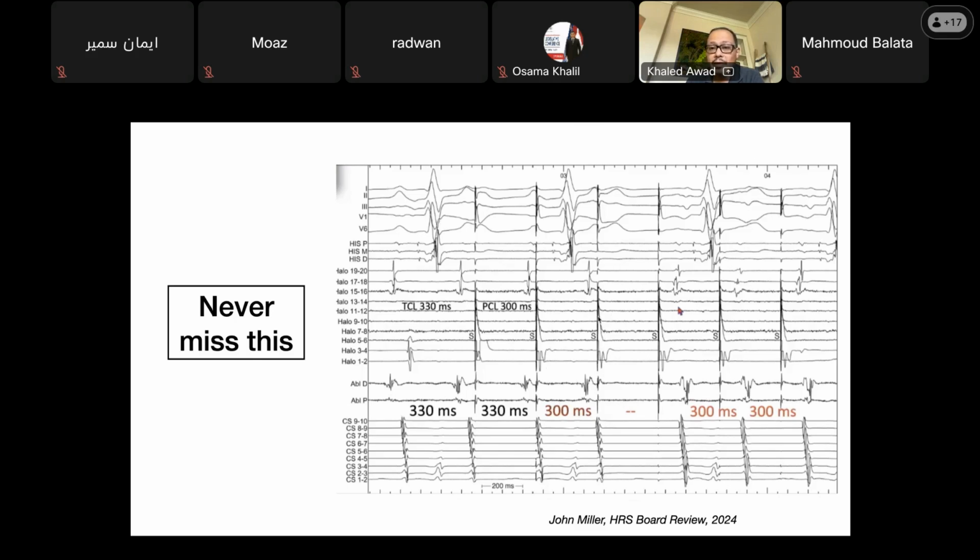Why did this terminate the tachycardia? Although it actually did not give us another P wave, it did not give us another set of coronary sinus electrograms, and it happened right in the middle of the P wave. You see the P wave right there, and you see the coronary sinus right there. That stimulus fell when the coronary sinus was committed. Half of the atrium was committed. Okay? So how could a stimulus that doesn't propagate, doesn't capture anything that we can see either intracardiac or on the surface, how can it terminate a tachycardia? It has to be in the critical isthmus. It essentially creates a wavefront that then collides with the wavefront of the tachycardia and causes the tachycardia to terminate.